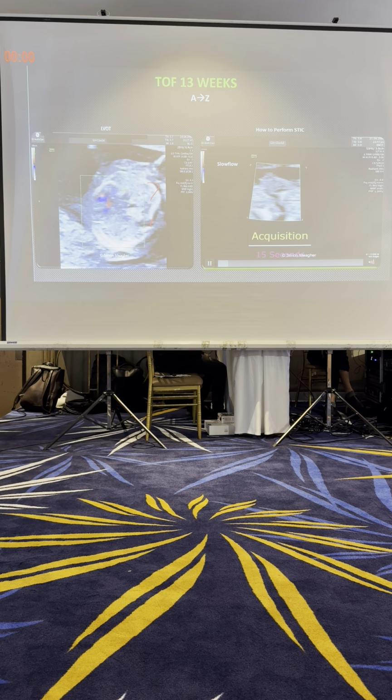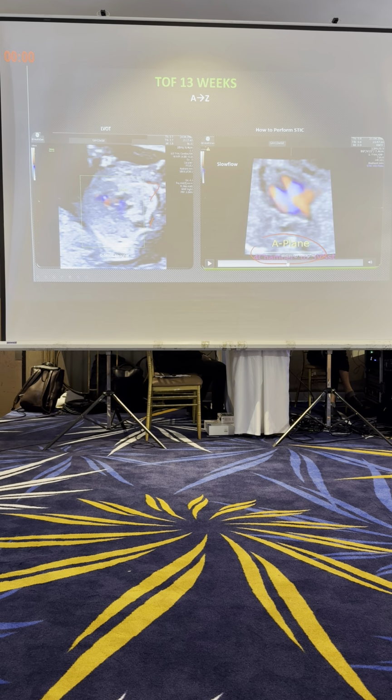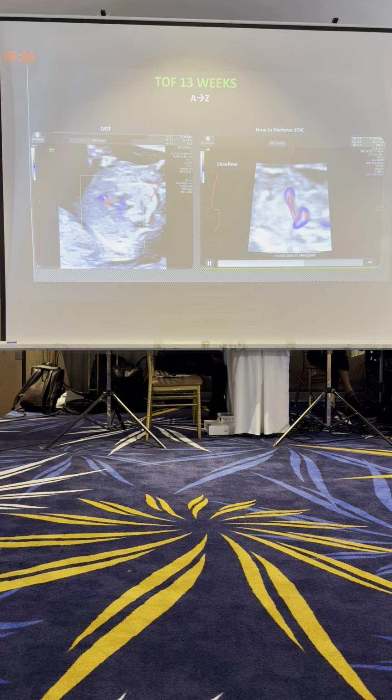I ask the patient to hold her breath for 15 seconds. I acquire from the neck down to the stomach in 15 seconds as she's holding her breath, and I do a 4D STIC acquisition. Once I've got the STIC acquisition, I now have a beautiful view of this heart, which is 1 centimeter here, and here to here is 1 centimeter, 7 millimeters across. Normal 4-chamber, I can see the aorta sitting astride, I can see the question mark configuration, and I can see the pulmonary artery coming out with the Y configuration. I can see everything on a single STIC volume acquisition. I can see everything pointing to this baby having tetralogy of Fallot.